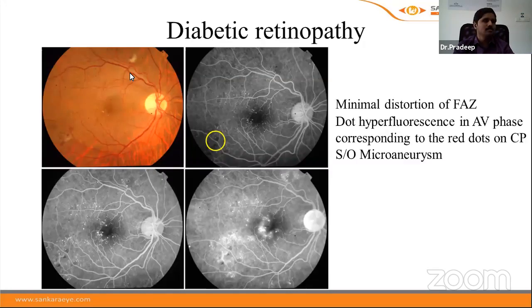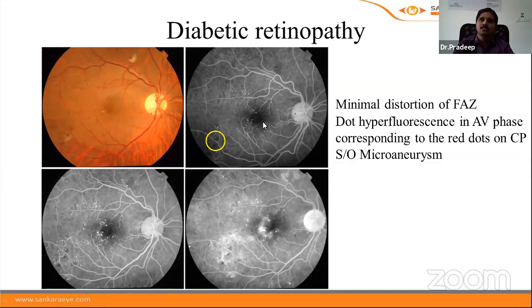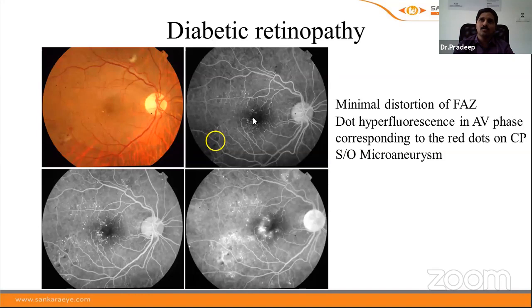In diabetic retinopathy, we can see minimal distortion of the foveal avascular zone — almost intact — with perifoveal microaneurysms temporal to the fovea. Multiple dot hyperfluorescence in the arteriovenous phase corresponds to red dots on color photograph, which is suggestive of microaneurysms. There is also blocked fluorescence due to cotton-wool spots and hemorrhages.